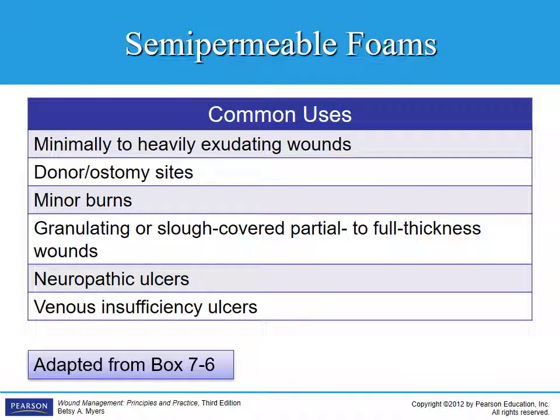Common uses are minimally to heavily exudating wounds, donor and ostomy sites, minor burns, granulating or slough-covered partial to full thickness wounds, neuropathic ulcers, or venous insufficiency ulcers. The neuropathic, and as you'll see when we get into those, neuropathic and venous insufficiency ulcers are very, very wet wounds.